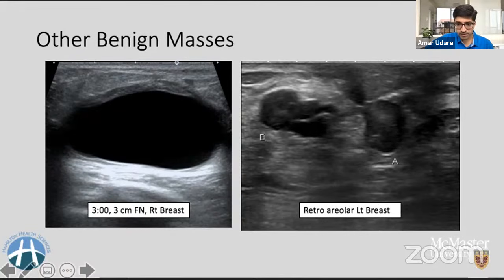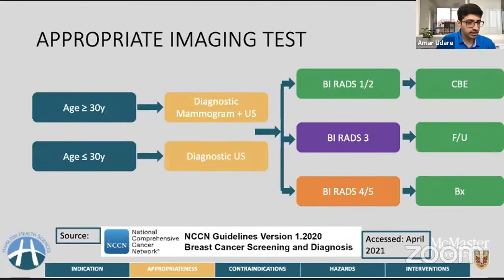So just for reference, I'm just going to bring up this slide and keep it here, and then look at the chat section to see if there are any questions. So Zelda has a question that in her training, limited mammograms, bilateral MLOs, are performed in patients under 30 years old. If there is a suspicious US finding, what are your thoughts about that?